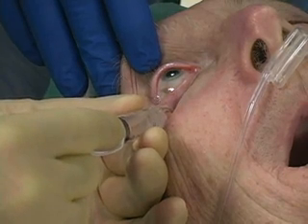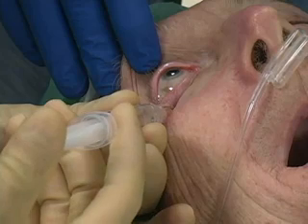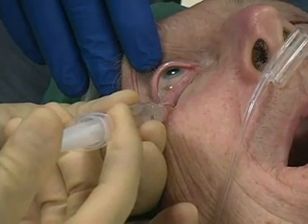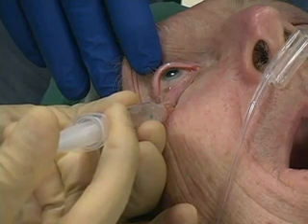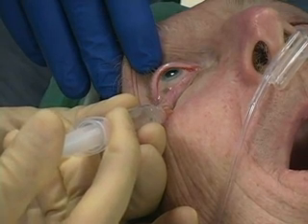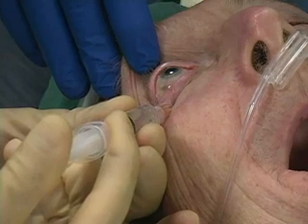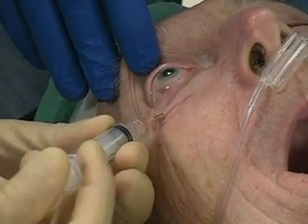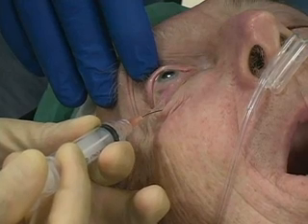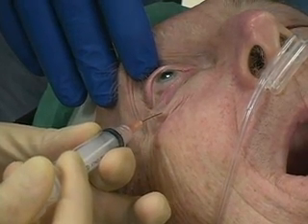Carefully aspirate the syringe to ensure that the needle tip is not located in an artery or vein. Slowly inject 2 to 4 milliliters of the anesthetic mixture. Watch the eye carefully. As the anesthetic is injected, the increasing volume under the orbit causes slight proptosis. As you withdraw the needle, inject 1 milliliter of anesthetic to provide anesthesia to the orbicularis oculi muscle.